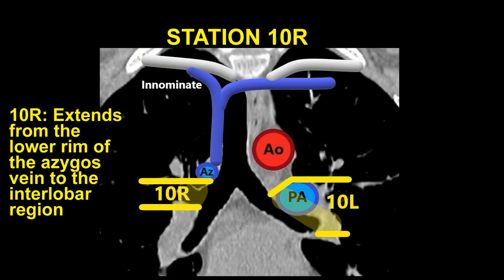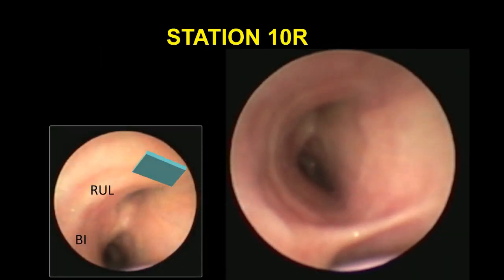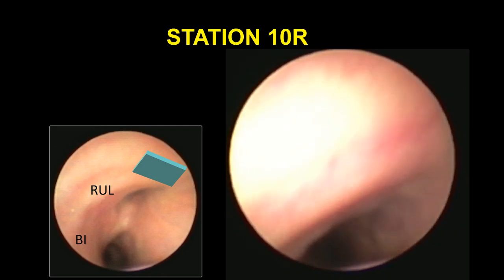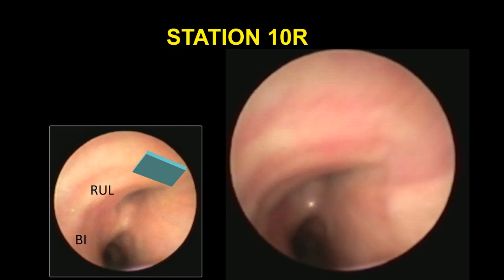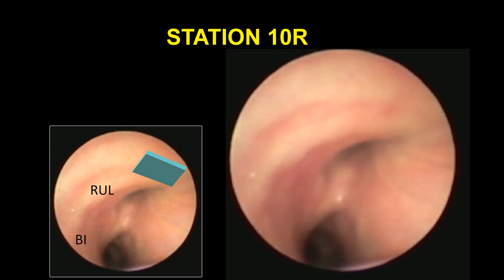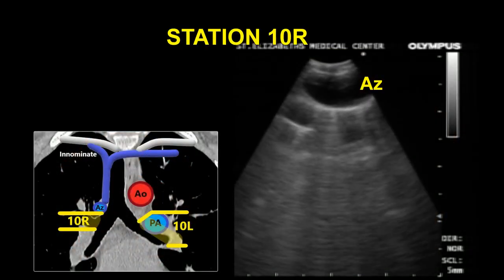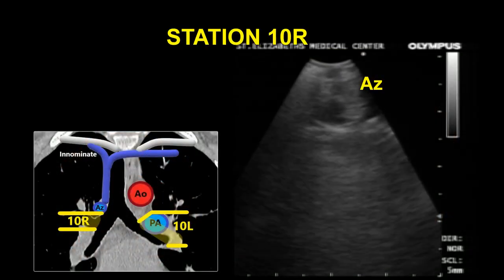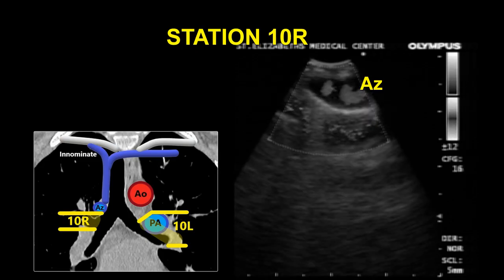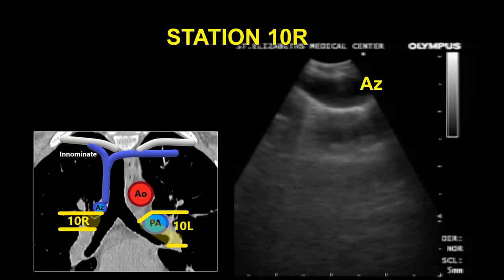Station 10R, the right hilar node, extends from the lower rim of the azygous vein to the interlobar region between the right upper lobe and bronchus intermedius. To visualize this lymph node station, the EBUS scope can be advanced from the main carina to the origin of the right upper lobe bronchus with the probe oriented towards the anterior and right lateral walls. In this view, the scope is oriented laterally so that the node is located distal to the azygous vein, which is seen at the 3 o'clock position proximally.